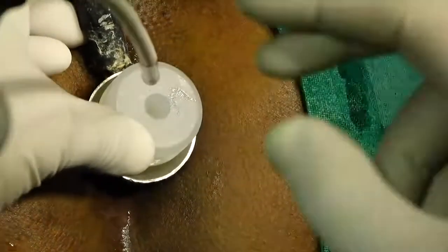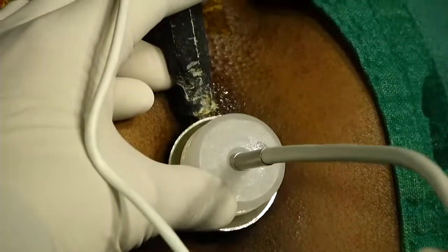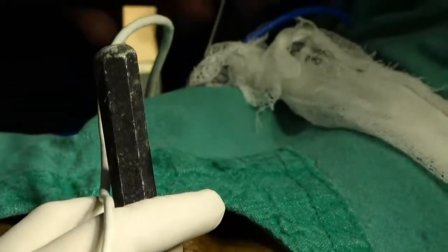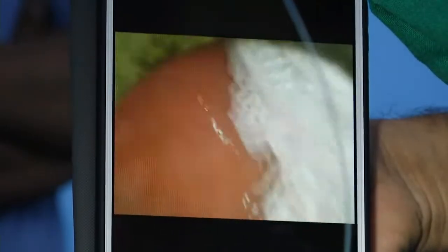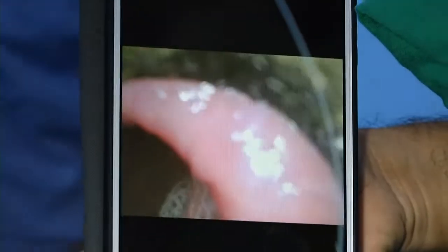Yeah, this is an endoscope made by this company. Focus. Light off. Yeah, you can see, focus properly. Yeah, we are in the rectum, you can see. Now coming outside.